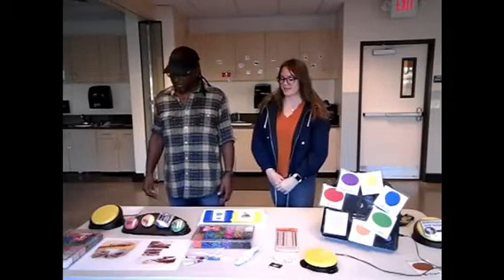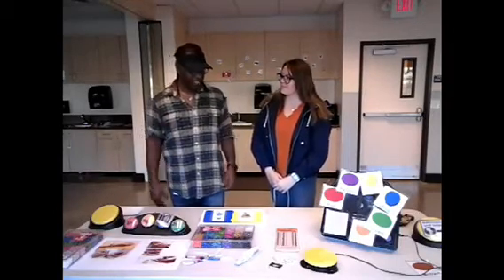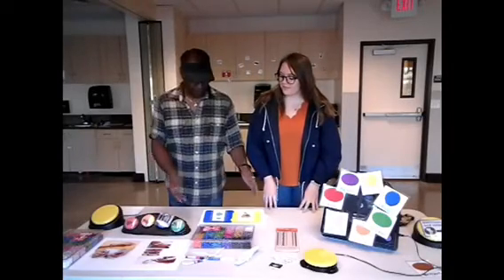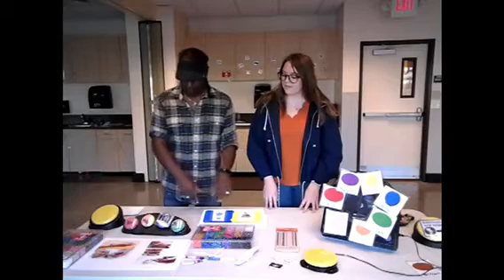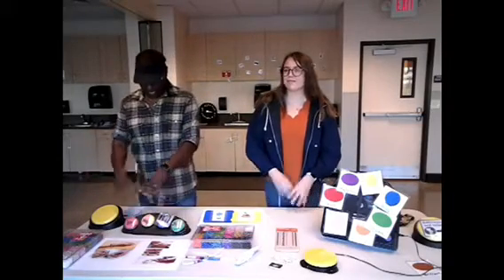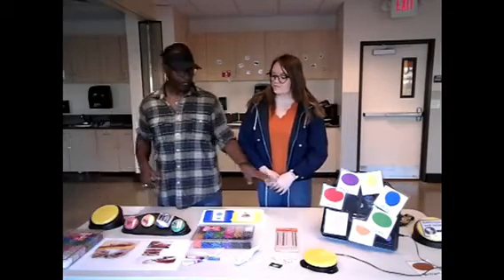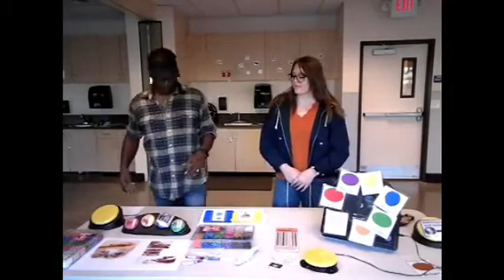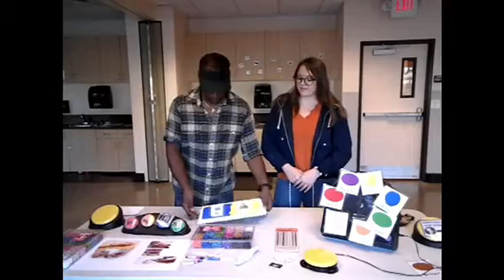We're going to be doing this exciting video about how to utilize switches on the table, the ones we have set up for you. We have a dual switch here, we have a multi-switch here, and we have a single Big Mac here. We have a spin wheel here. We'll show you how to use that. So, Cassidy, we're going to show them how to use the dual switch.